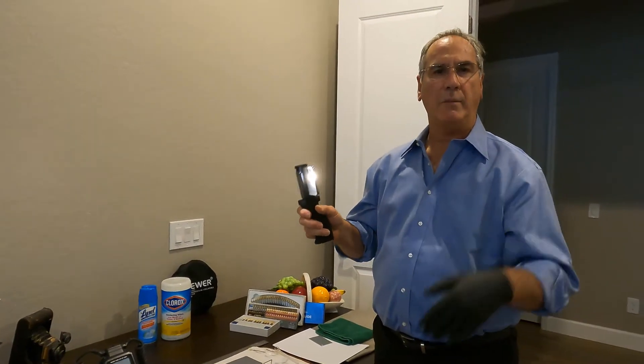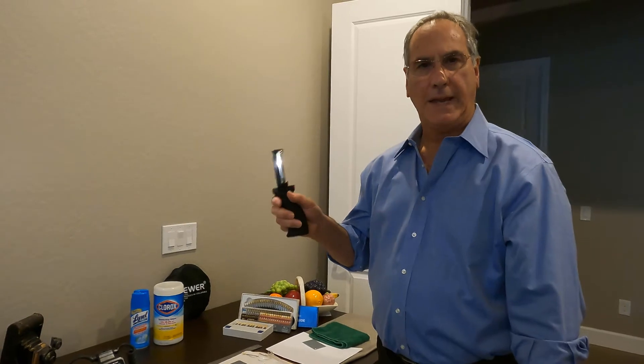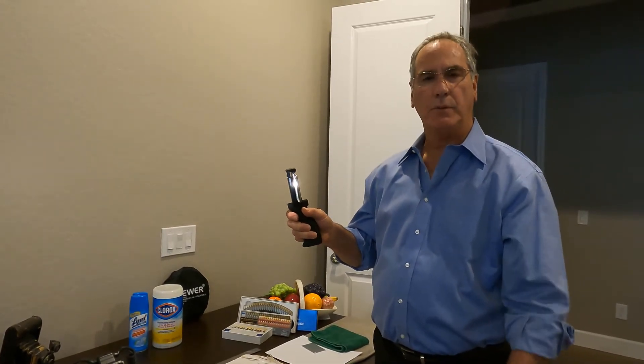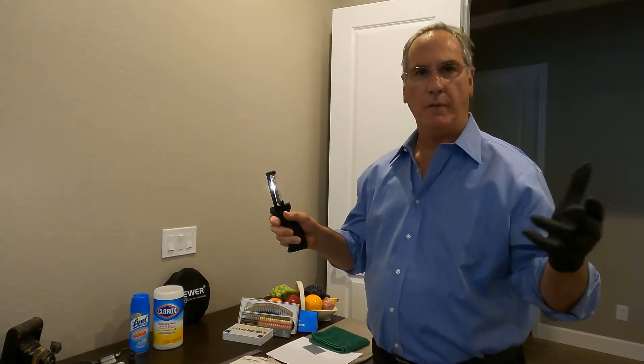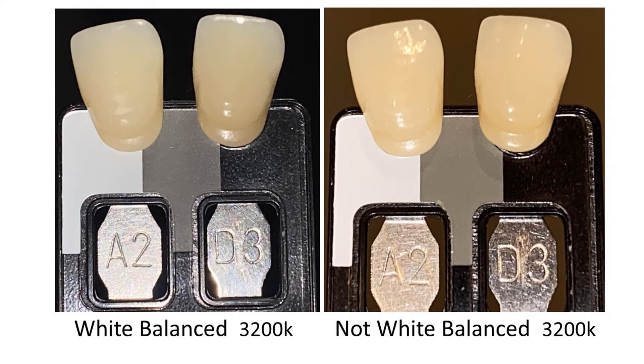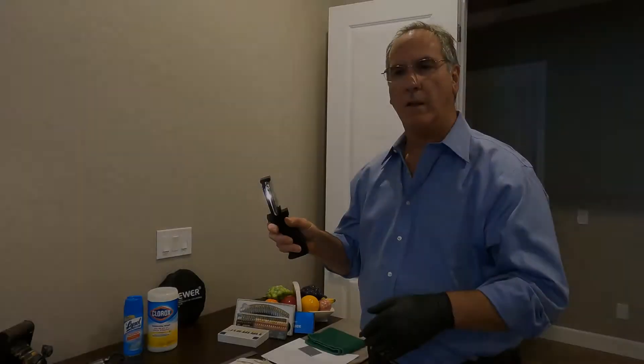What we're going to do next is white balance the camera. This is true of any camera. You should do it in your operatory or your shade room, wherever you make photos, because the lights definitely affect the color of the photo unless you white balance it.